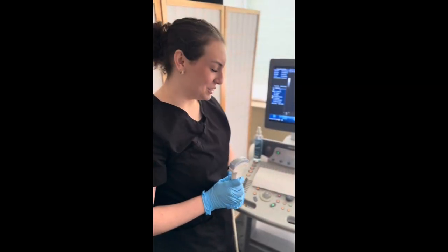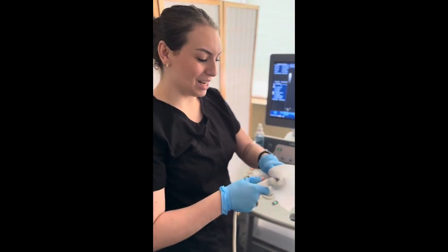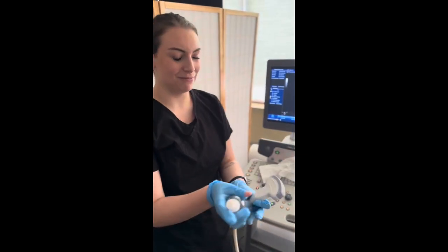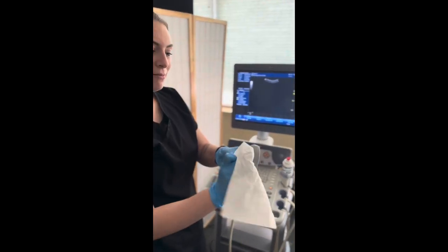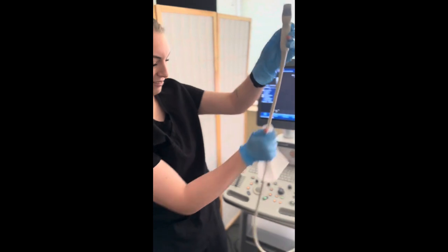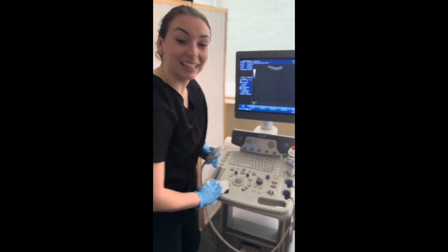One of the last things we're going to do is wipe down our probe and do a dry wipe first. And then we're going to get it with our antiseptic spray, cleansing solution. Sometimes I do just a little bit more, trying to get through the corners. I go through my keyboard. And we call it a day.